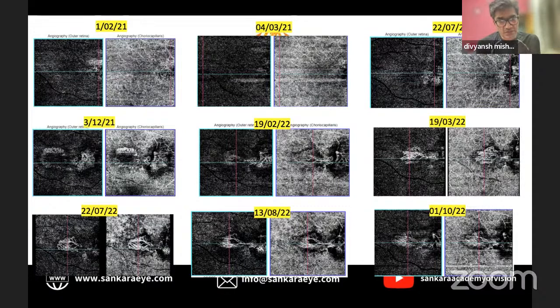The cause for recurrence is always debatable, whether how much to cover, how far to cover. Yes, ICG and FFA would have been the best marker.